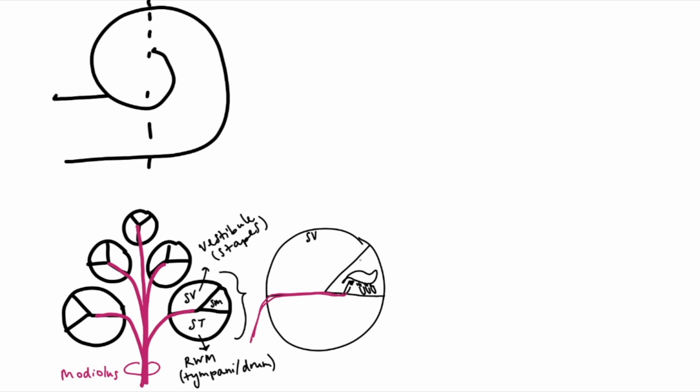Unfortunately, a thorough review of how the cochlea works and these different compartments is outside the scope of this video. Today's cochlear implants are designed to be passed through the round window membrane and into the scala tympani. Lateral wall electrodes lie along the lateral wall of the scala tympani underneath the organ of Corti. Lateral wall electrodes are thin, reliable, and easy to insert with a one-handed insertion.